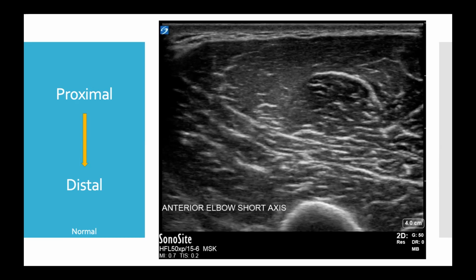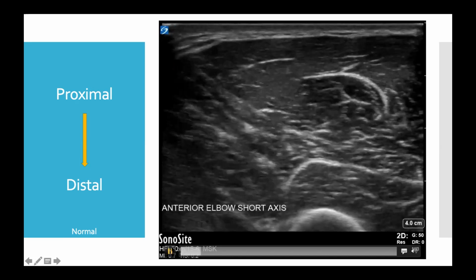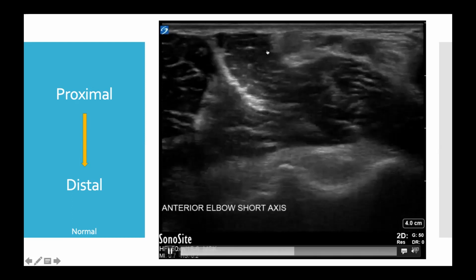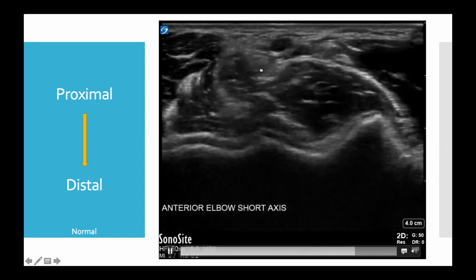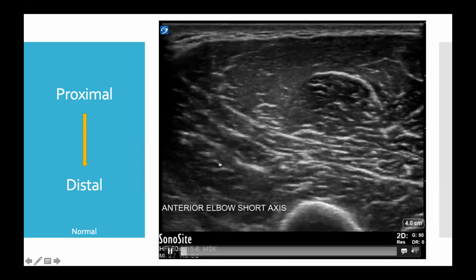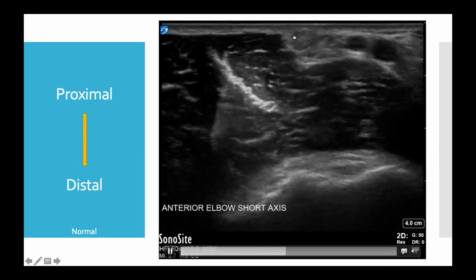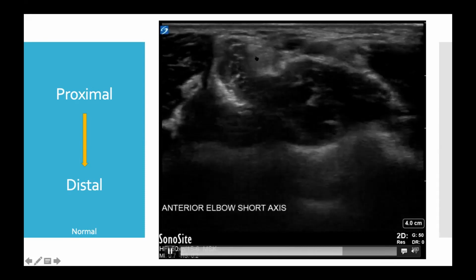This is the first clip that I have. It's starting proximal, gliding the probe distally, and really finding and following down the biceps muscle to where the musculotendinous junction and tendon then form. I'll just play this for us. If we look right at the top of the screen where the cursor is, we can see where the biceps tendon begins to form. The biceps comes down and we begin to form the musculotendinous junction, and then it further coalesces into the biceps tendon.